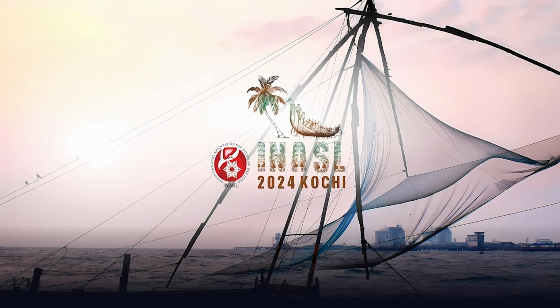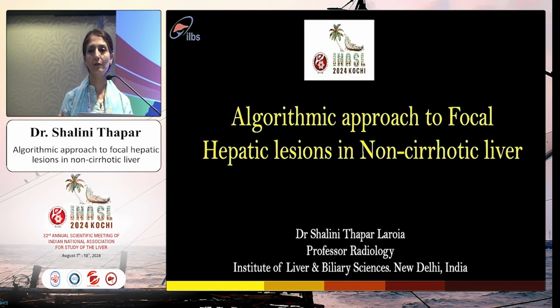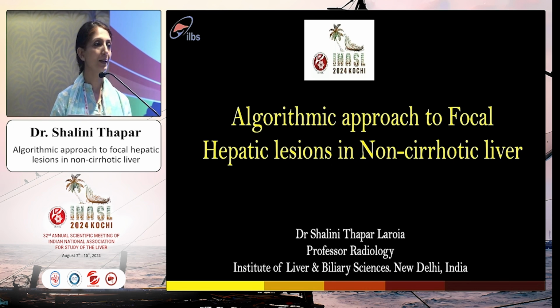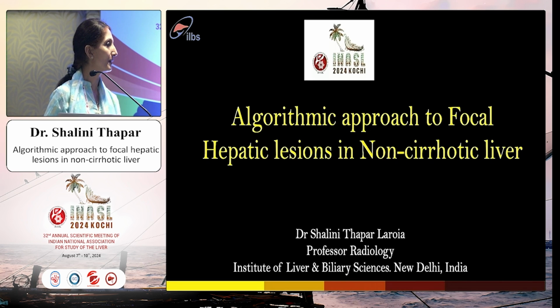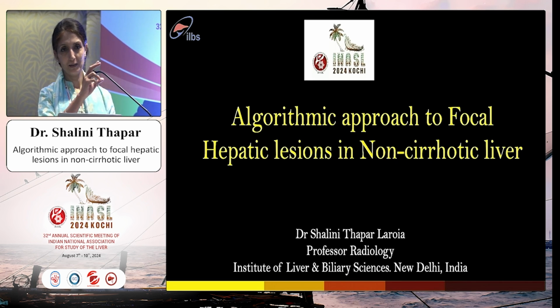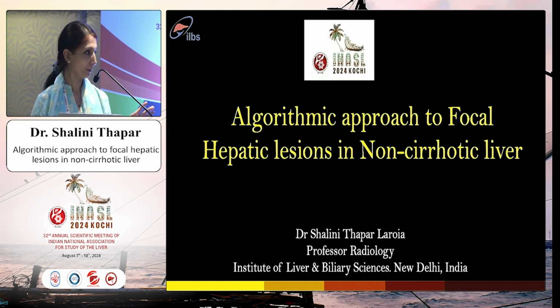So, how many of you perform your own ultrasounds and try to have a look at the CT or MR films and guess what lesion that is? Any show of hands? How many of you practice ultrasound here? No, apart from the radiologist. So, okay, I don't think this cozy group is doing much ultrasound, because in our institute they all try all the time, but the word is try.